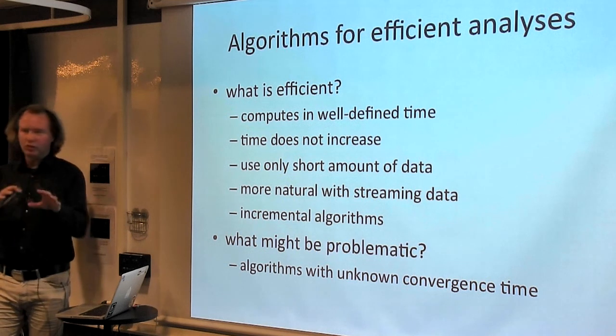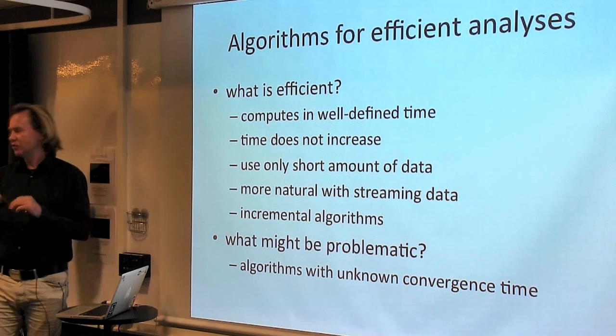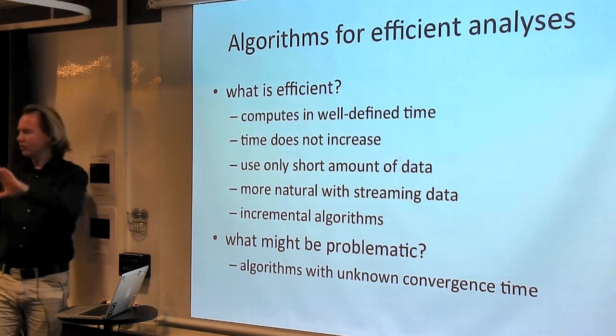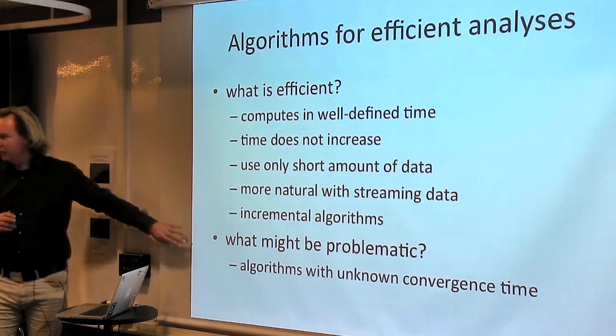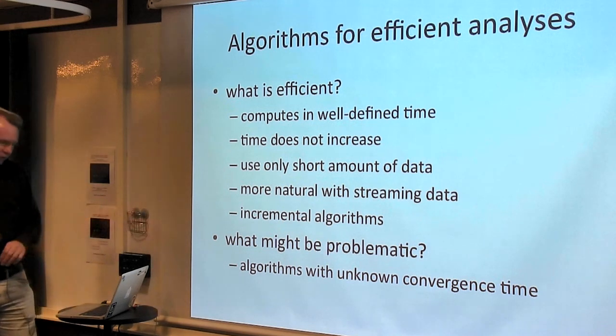The thing is with a real-time head localizer, we don't care if it occasionally skips a piece of data. So we just always jump to the last piece of data and we perform the head localization and the visualization. But that's just something that you have to keep in mind, that some algorithms have unknown or unspecified timing characteristics.